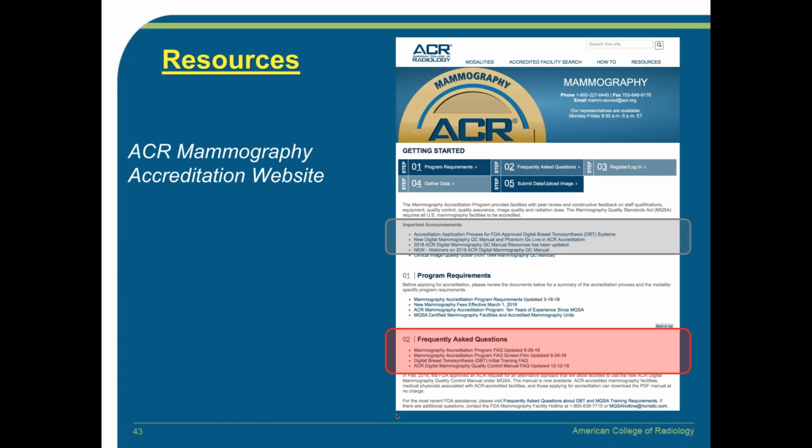So the answer to the first question is no, facilities do not need to switch to this program. It is your choice. The ACR manual is an approved alternative standard under MQSA, which means it is considered substantially equivalent to the manuals that are out there. So the test and the manual has been approved by the FDA MQSA program, and facilities are allowed to switch to this manual and do the QC in this manual and not their manufacturer's QC test.